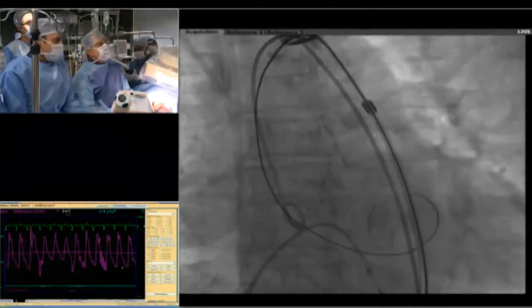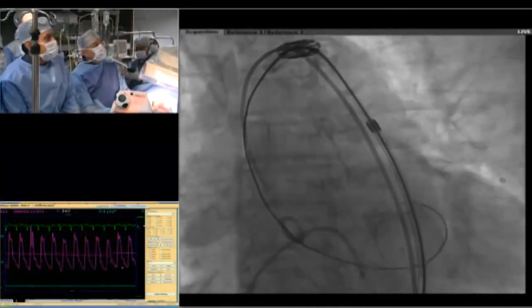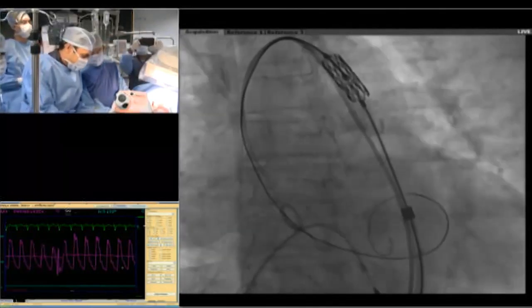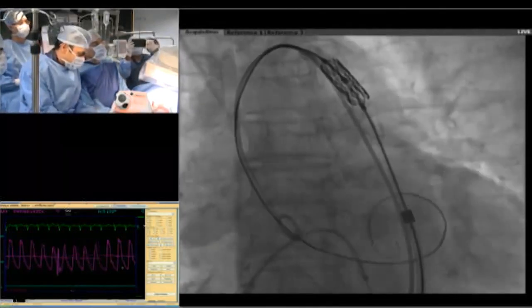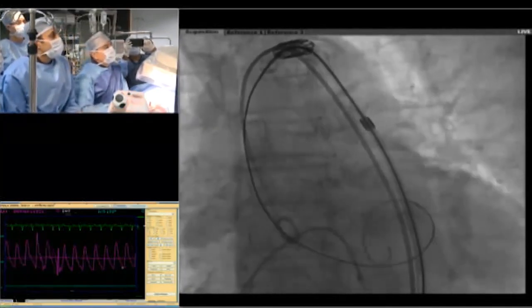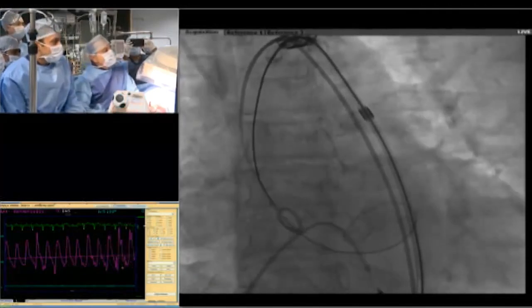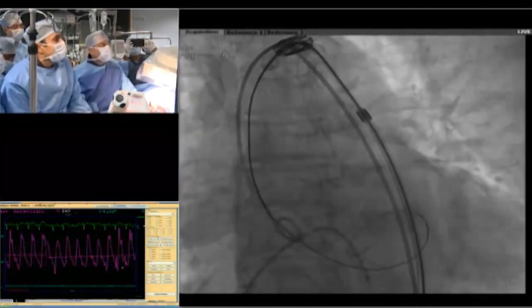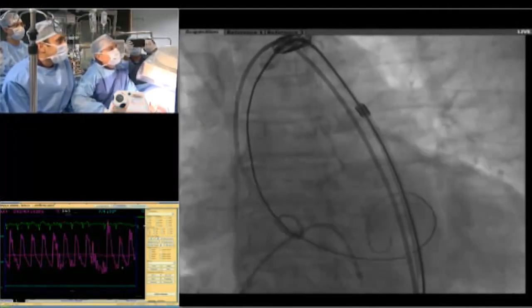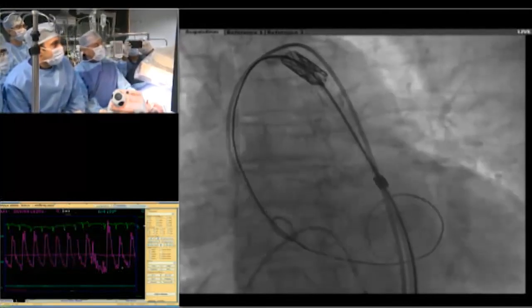So what we'll do is we'll come back again. Maybe we'll give more torque here. So you can see here how the valve has caught, the whole system has caught onto the catheter there. We'll talk about it more. So this is the navigator catheter. Let us try to go in now. Let's be careful with the wire. Okay. My hands are slipping. Give me one minute here. Let's come back again. Just push the wire a bit.